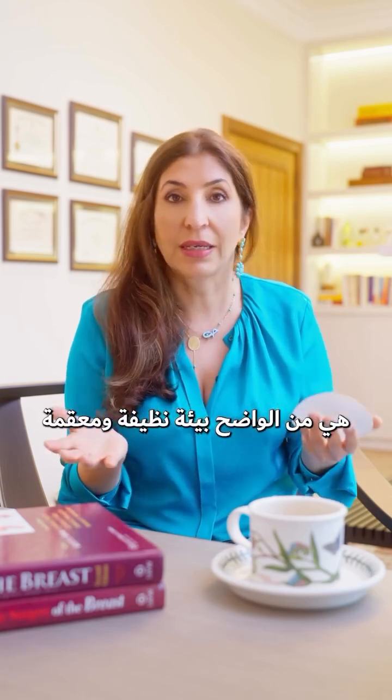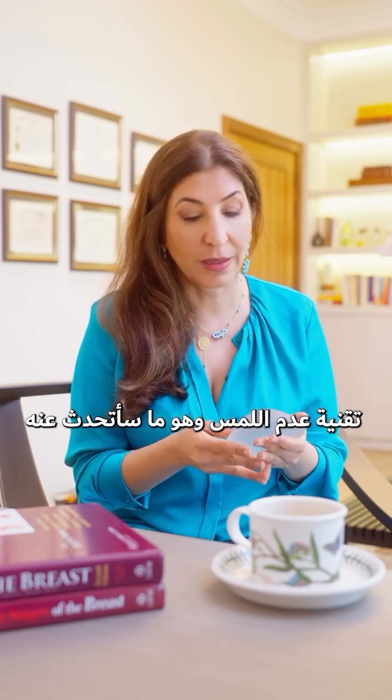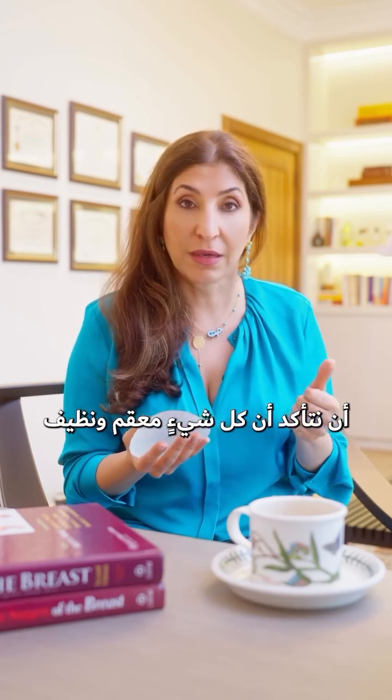Number 1, we use obviously a sterile environment, scrubbing, prepping the breast, and we try to do something called the no-touch technique, which is what I'm going to talk about. So the first thing is we make sure that everything is sterile.